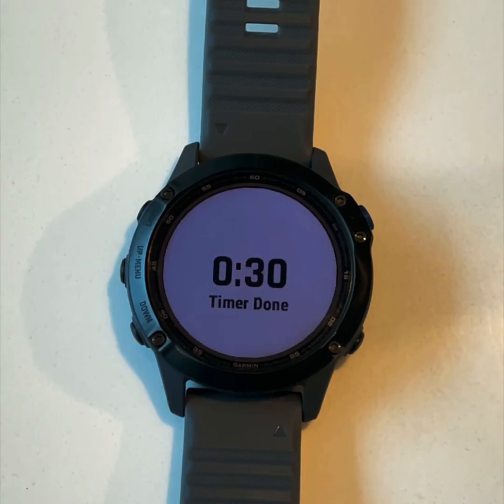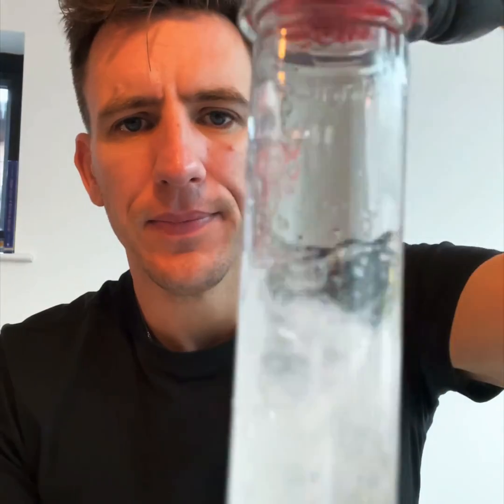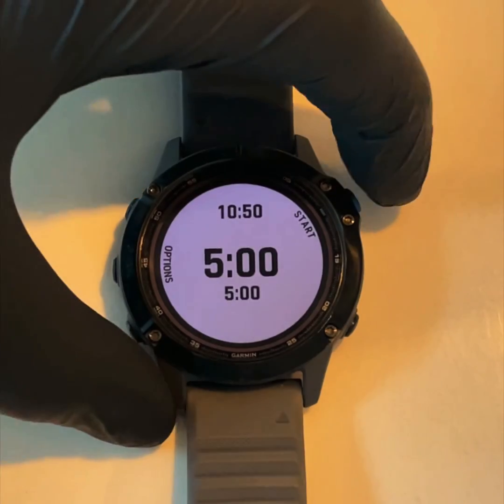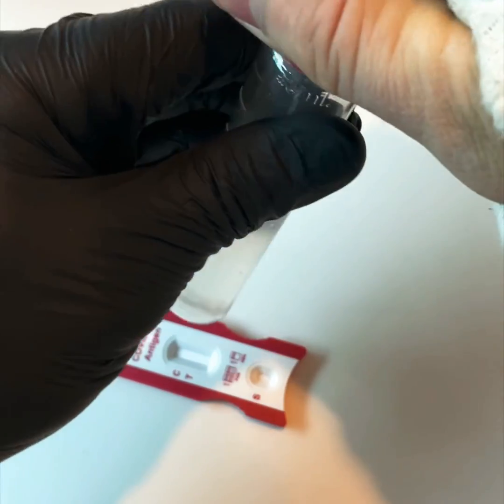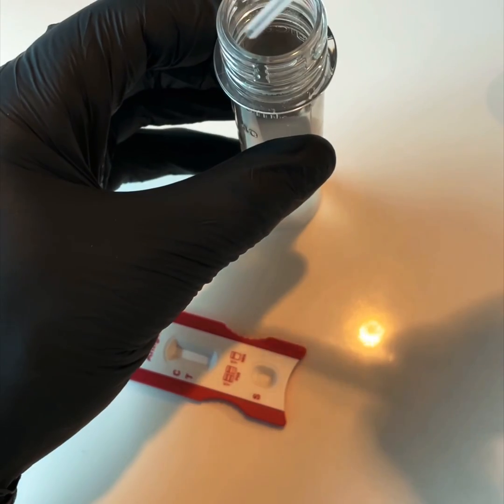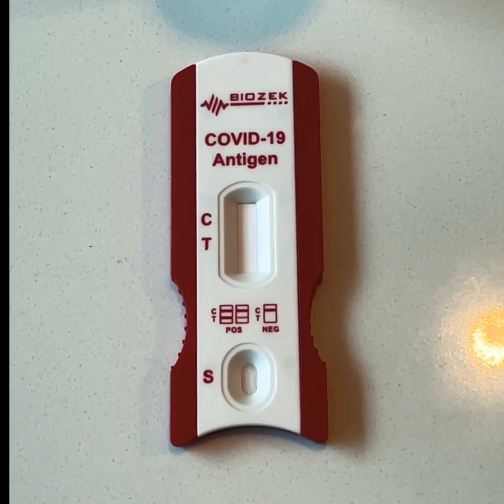Use your pipette and draw out a couple of ml, then place it onto the reader. Between five and fifteen minutes later you're going to get your test result. Simple. Put a couple of drops on.